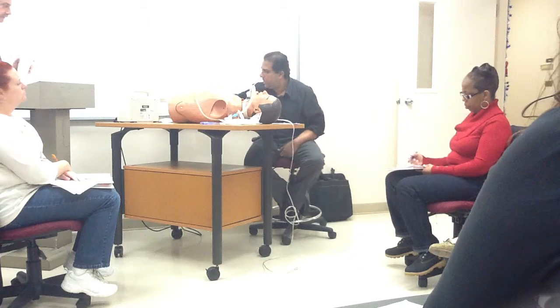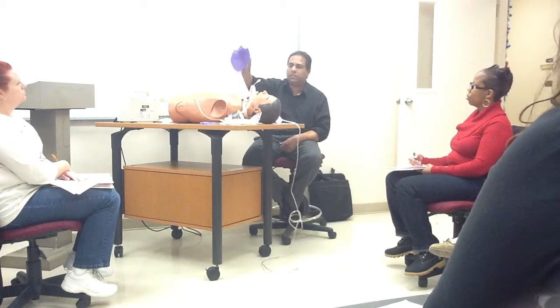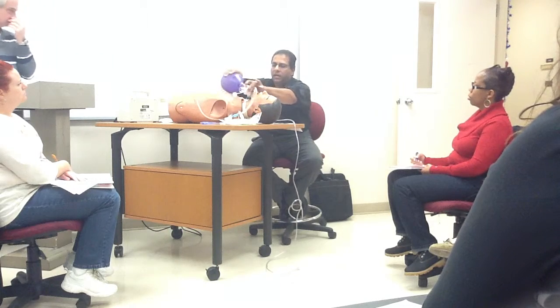Okay. All right. So if they are not on the ventilator, you could either ambu the patient with 100%, take the patient off, whatever, and bag the patient.